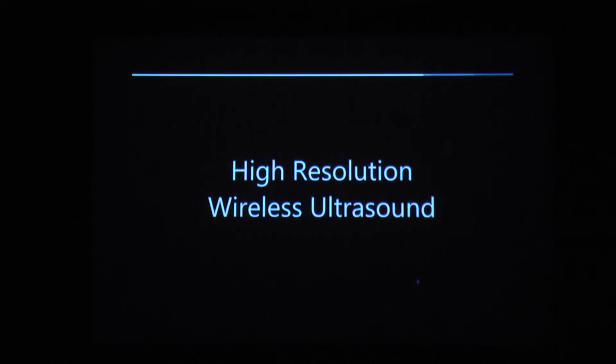Robert, can you show us how it is on the tablet? You can see it's a tablet, so it's small, but you can see the moving imagery which we have done on the tablet, the same demonstration. Can you turn the light on, please?